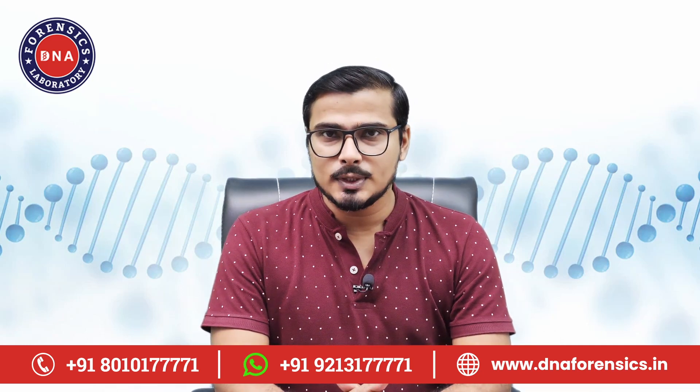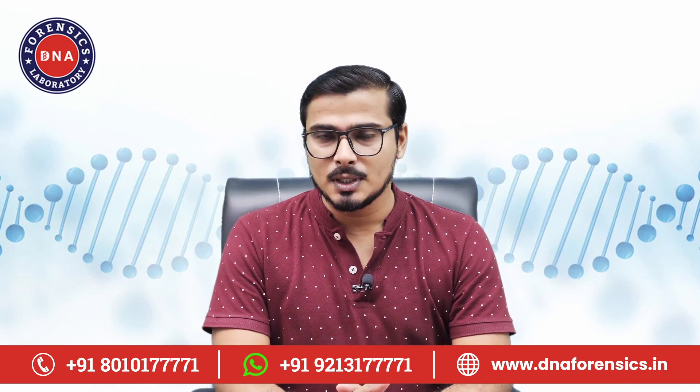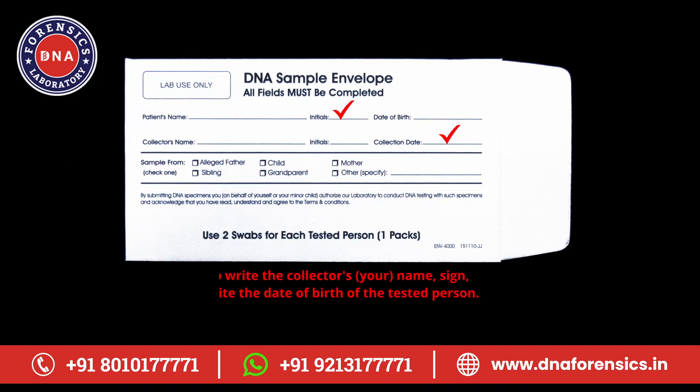First of all, write the names of each of the tested persons on separate envelopes. Here you will sign and enter the date of sample collection. In the sample from section below, you will have to tick the checkbox of your relationship with the other tested party.